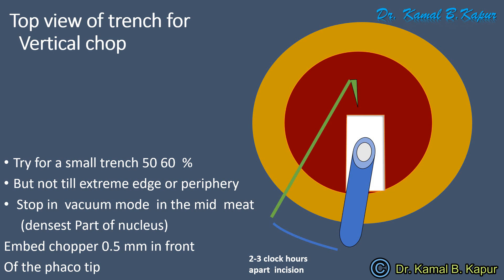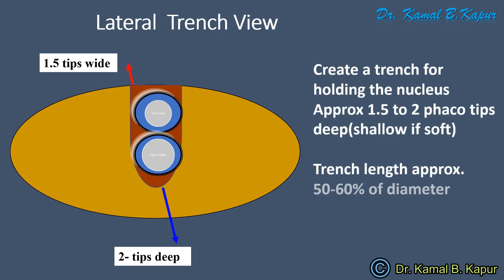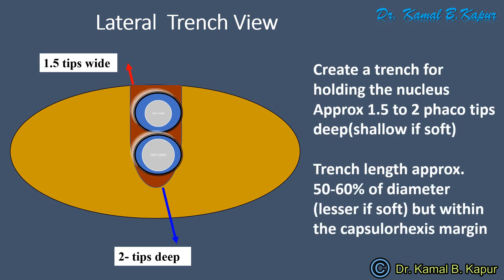Now let us see the parameters. The lateral view of the trench will demonstrate approximately two FACO tips deep trench. If the cataract is hard, you can go for two and a half to three FACO tips deep, but in a normal moderate grade two to grade three cataract, a two FACO tip depth is good enough. Make sure the trench is slightly wide on both sides so that the sleeve doesn't get stuck while creating the trench.